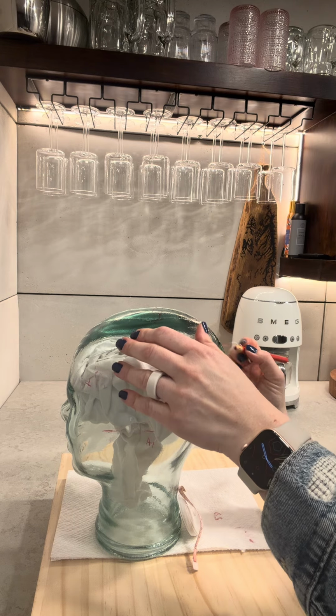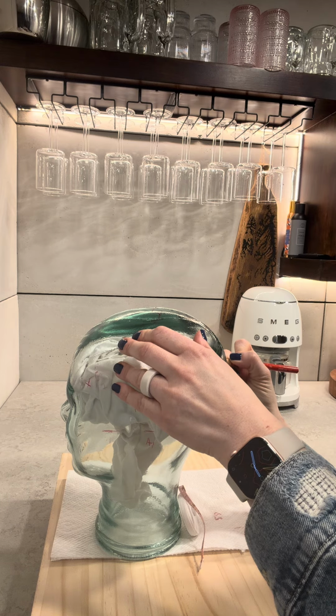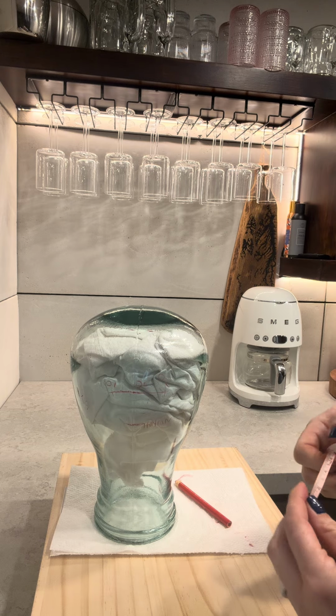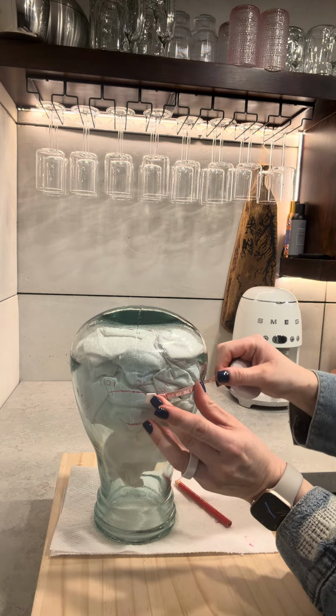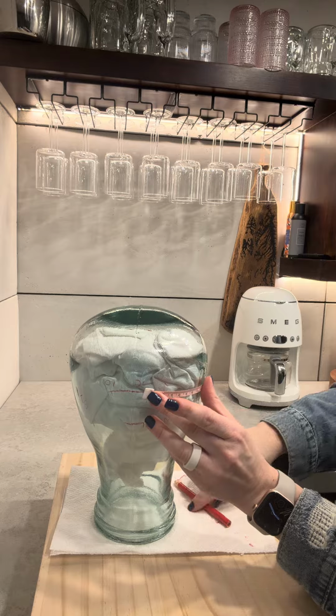Okay, and this is my O2. I'm gonna go ahead and measure 5.9, which is 10%, to 10% line.